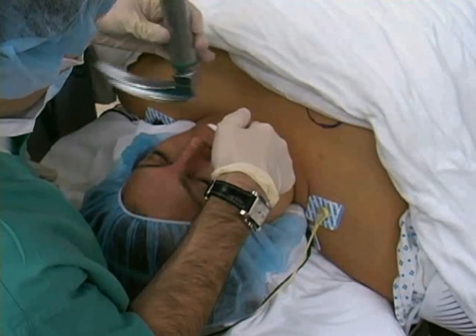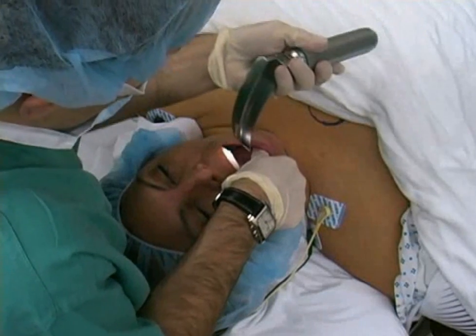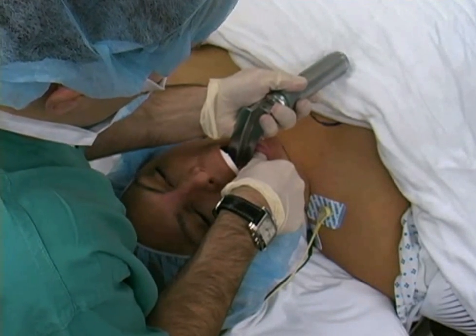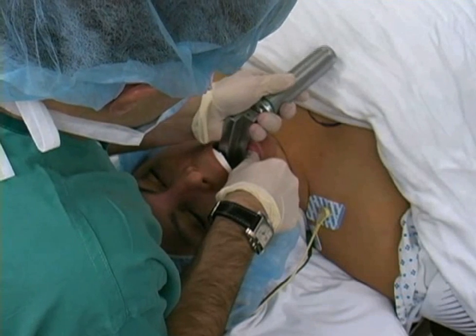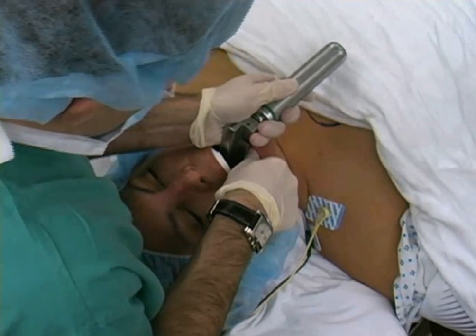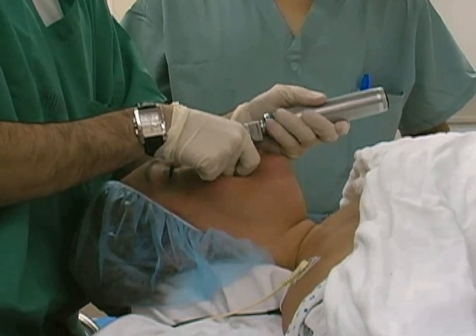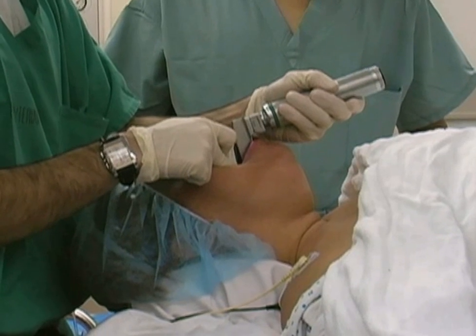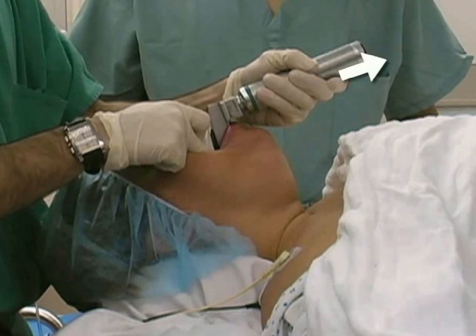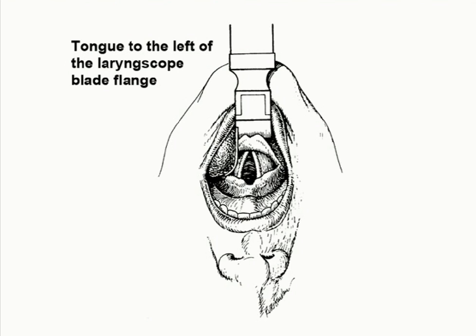With the laryngoscope blade extended, grip the distal part of the handle in your left hand. Stand at the head of the bed and scissor open the oral aperture with your right hand. Gently sublux the jaw. Insert the blade into the patient's mouth to the right of midline. Gently sweep the tongue to the left, ending the motion when the laryngoscope is aligned in the middle of the mouth. Advance the blade, looking for the epiglottis and vallecula. When the tip of the blade enters the vallecula, use the handle to lift upward and outward, such that the blade handle points toward the ceiling corner. Visualize the glottic opening. The Macintosh blade tip sits in the vallecula such that the epiglottis and glottic opening are visualized.